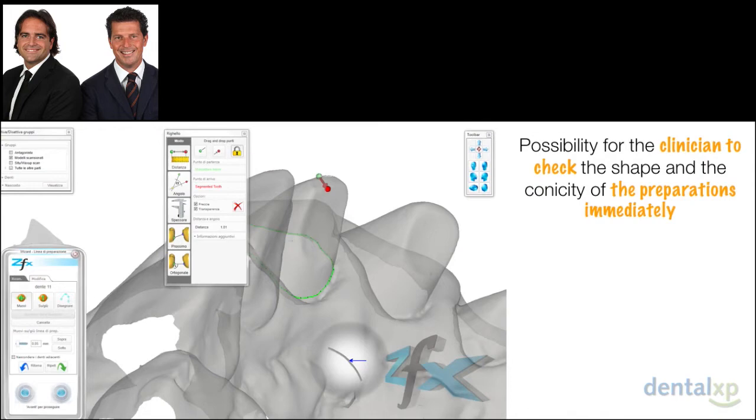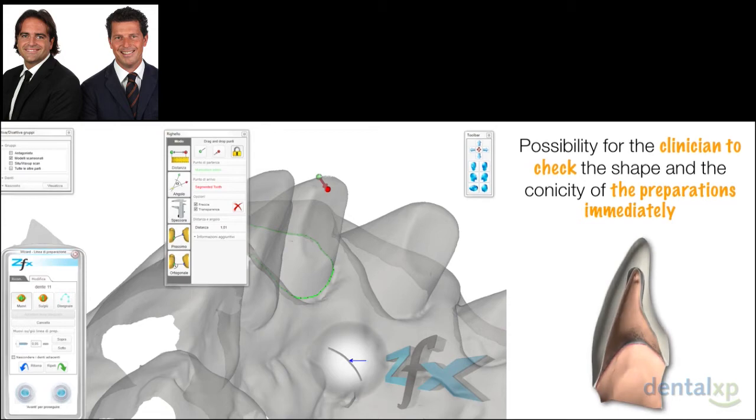We also have the possibility to check the shape and the conicity of the preparation in real time, because we want to have a determined, at least 1 millimeter, for example, occlusal length, in order to avoid voids, to be more predictable, and to decrease the risk of fracture.